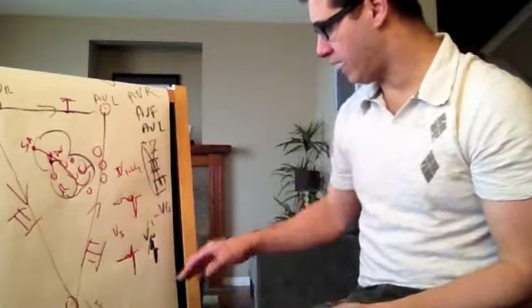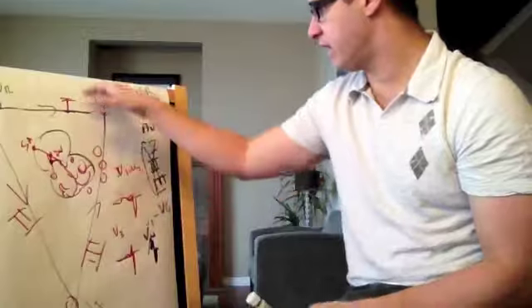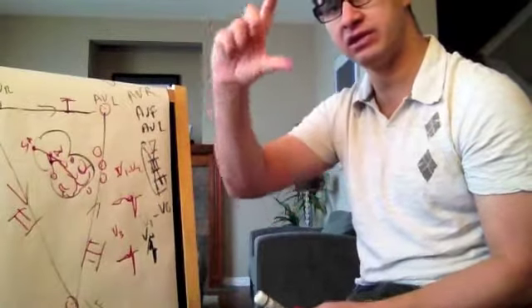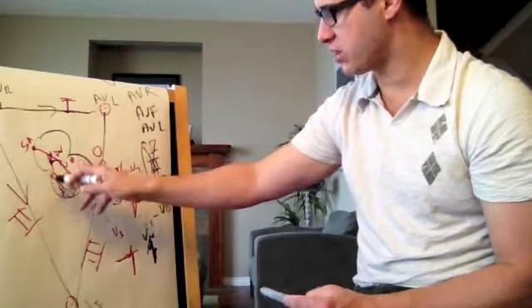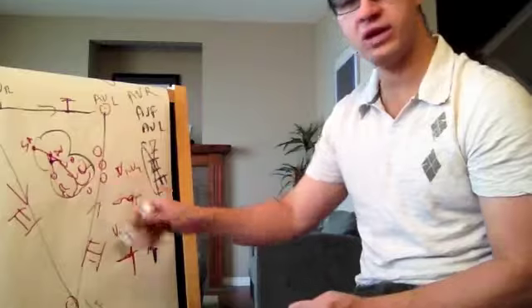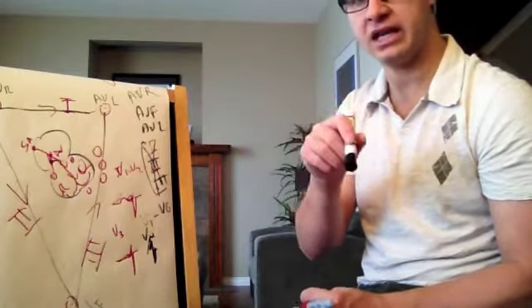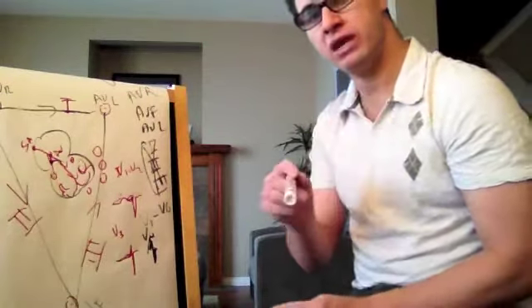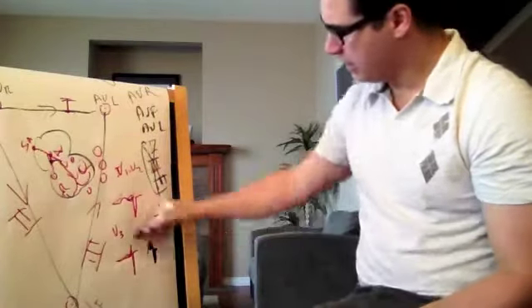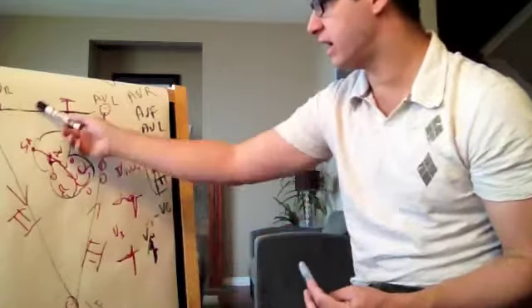So this is what a normal ECG would look like. So basically, the electricity will come. AVR, mostly everything negative. AVL, some positive, some negative. AVF, about the same thing. Sometimes they'll be exactly half-half, or sometimes they'll be different. And then after that, you come over here. V1 mostly negative. V2 mostly negative. V3 is kind of in between, a little bit of positive, but a little bit more on the negative than on positive. V4 mostly positive, a little bit of negative. V5, V6 hopefully pretty much no negative, all positive. And lead 2 all positive, because everything goes between this and this, and lead 3 mostly on the negative side, and V1 a little bit of negative.